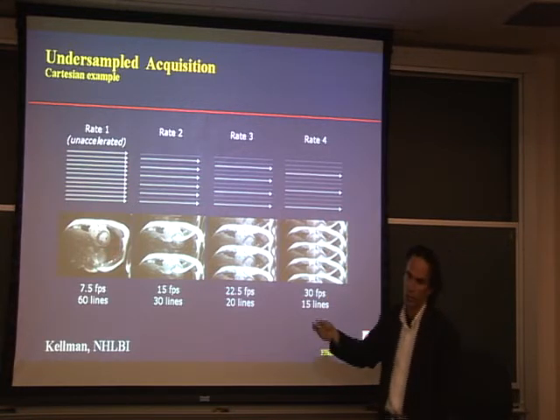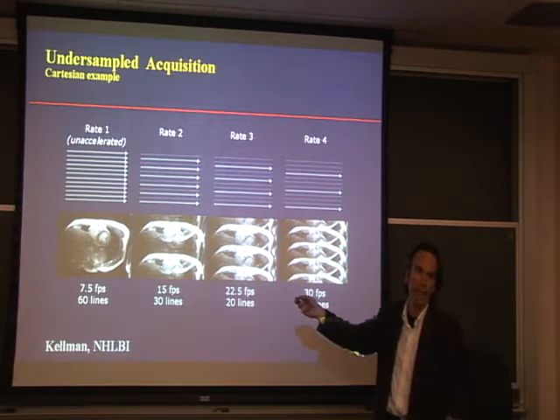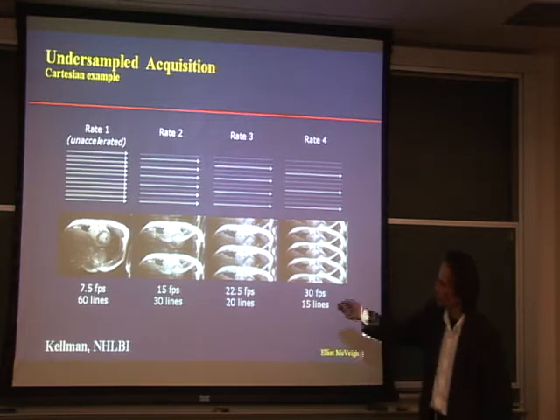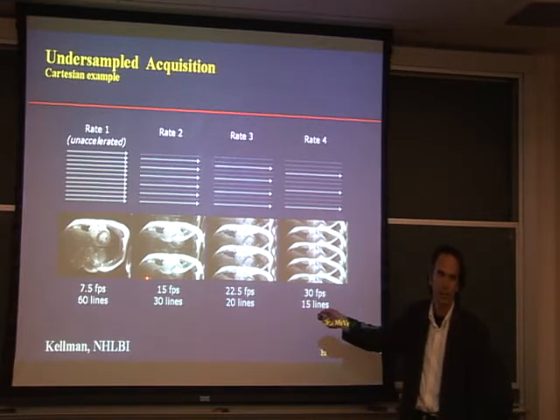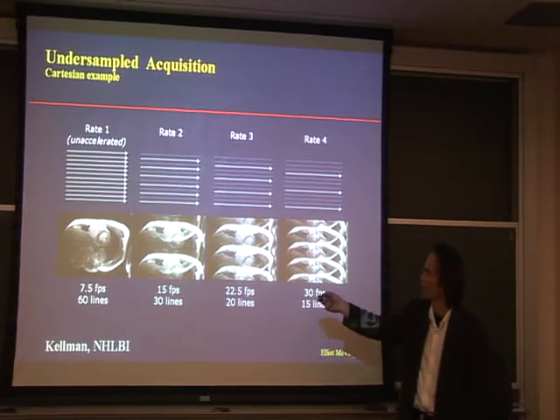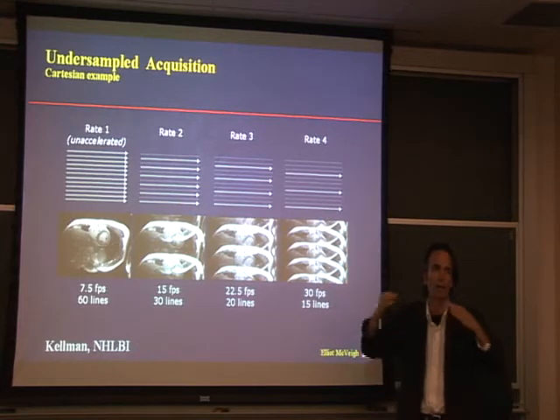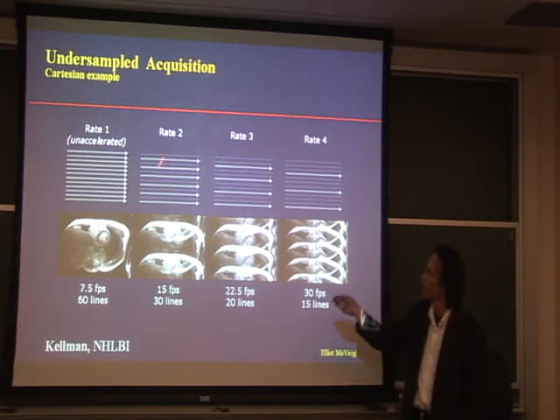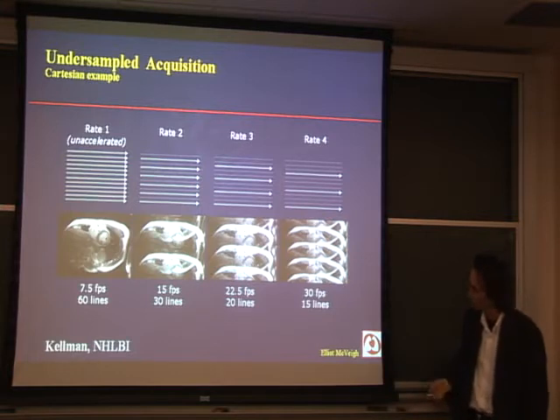What happens if we say, we have to go faster, let's just take every other line here. So skip every other line, and we'll just take half the data, so we can get it twice as fast. The picture comes out looking like this. And this is classic aliasing in signals and systems. You take the transform in this direction, and you're undersampled by a factor of 2, therefore you get a fold-over alias. If you're undersampled by a factor of 3, you get 3 copies, and these things get closer and closer together.